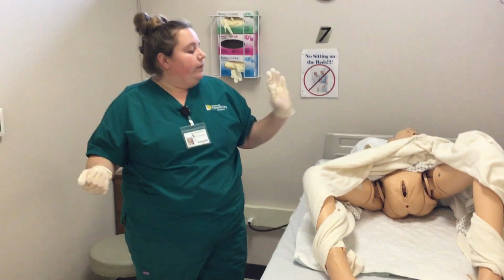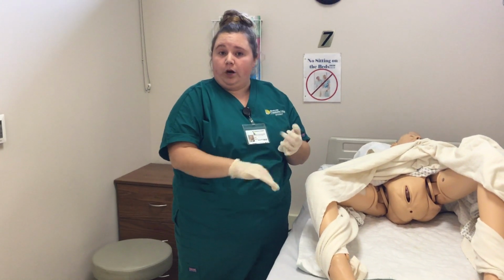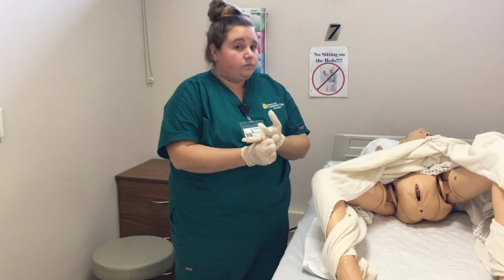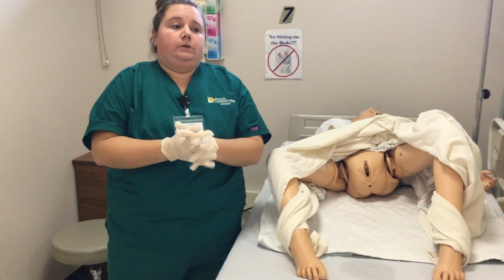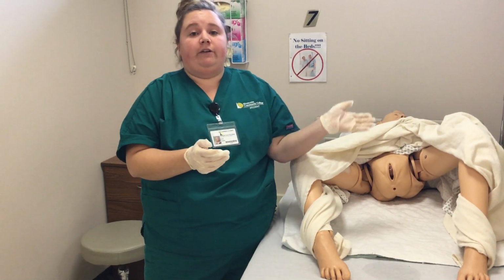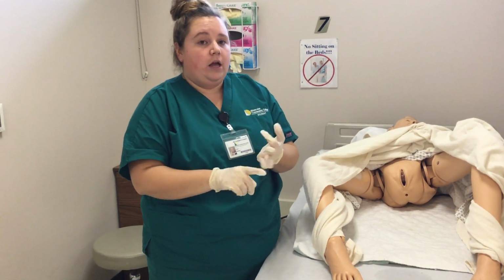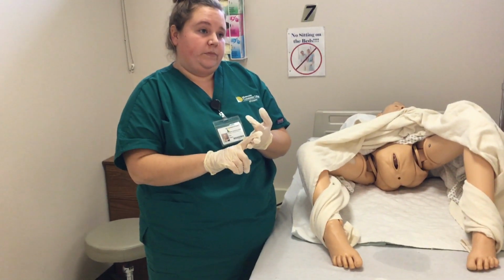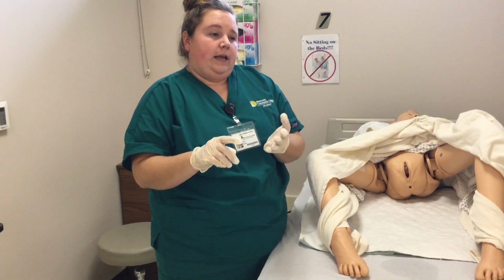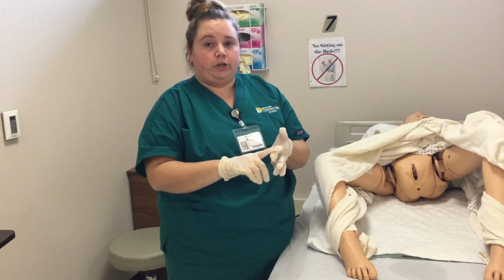At this time, I would do perineal care, washing with soap and water, rinsing with water, and patting dry. I'm going to identify the perineal area for any anatomical landmarks, erythema, drainage or discharge, discoloration, and odors.